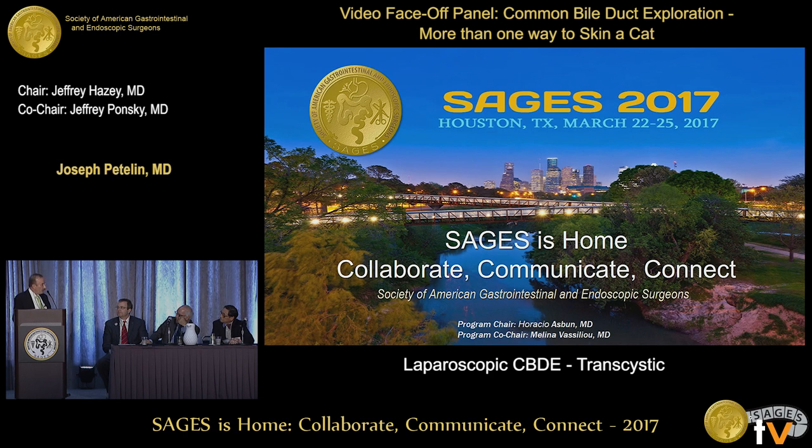a case where he had used the Gruntzig high-pressure balloon, and the patient had pancreatitis post-op. They can do that. We do this endoscopically, and I have done this antegrade at the time of lap chole, and we can get pancreatitis. But I think if you do it, you have to do it slowly, and you don't need to do it any greater than the diameter of the biggest stone. I agree. So it's something else I think we can do transcystically. Thank you.